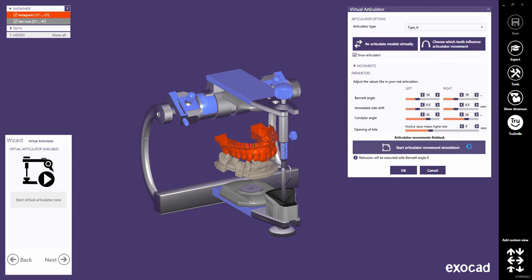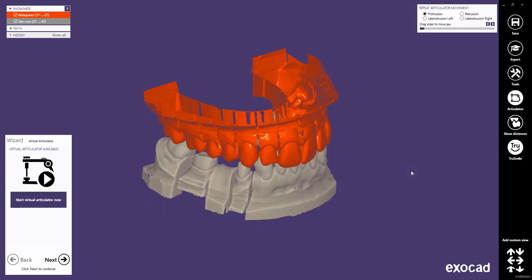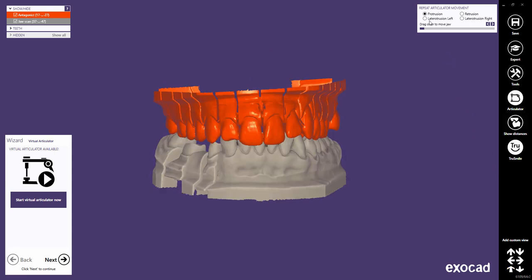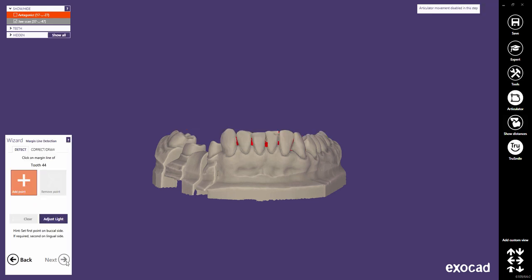When you close the Virtual Articulator dialog by clicking OK, a new window will appear at the top right corner of the screen. This window allows you to visualize and repeat the four main Articulator movements. The Articulator is not visible here — showing the Articulator is not necessary, as the virtual movements have been saved. Let's proceed with the next step, which is the Margin Line Detection.